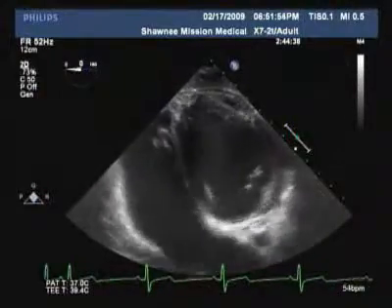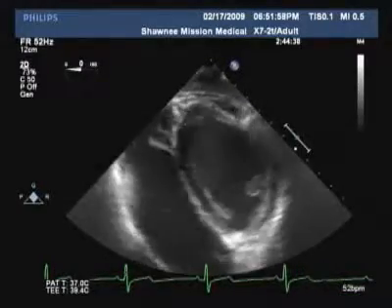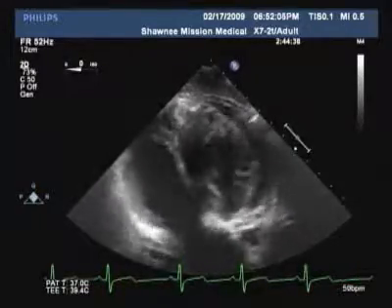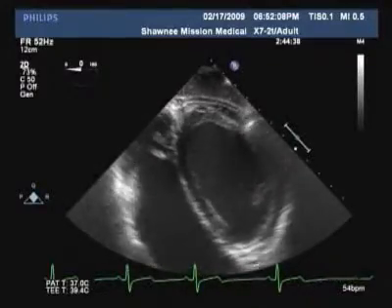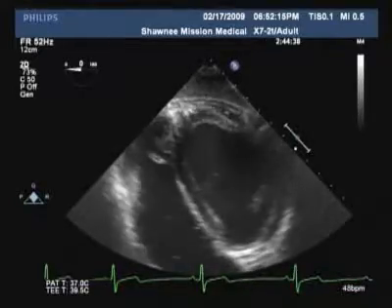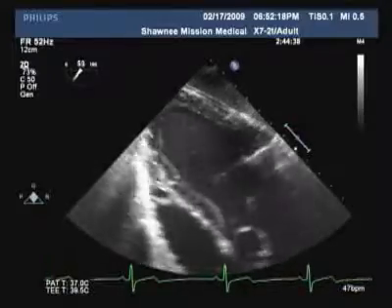What if a patient has a heart attack? What would you see there, or has what we call coronary artery disease? If somebody had a heart attack, or even sometimes in the midst of having not enough blood flow to that ventricle, we would see a wall of the heart, so where it's circular, and you notice everything moves in at the same time, everything contracts. And what we would see is potentially one of those areas not moving at all, maybe even bow out the opposite way when everything else comes in. So right now I'm going to go to a little bit different view.